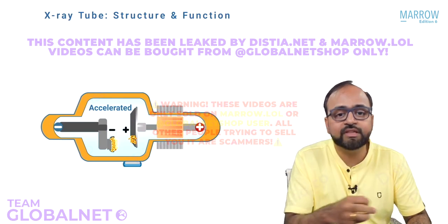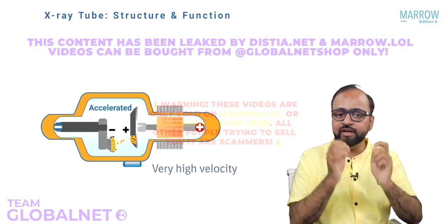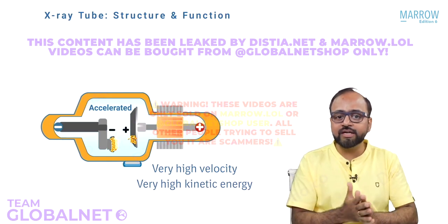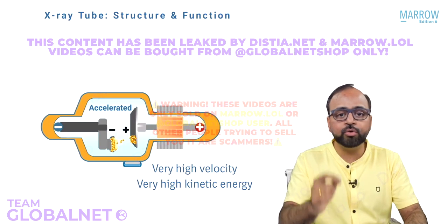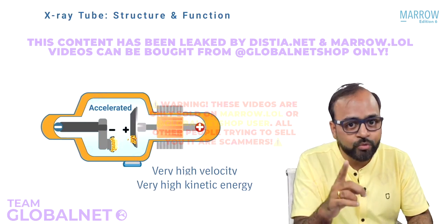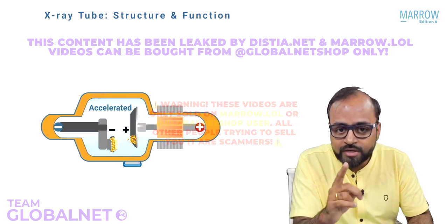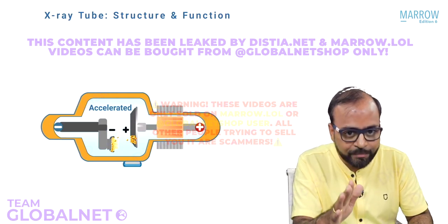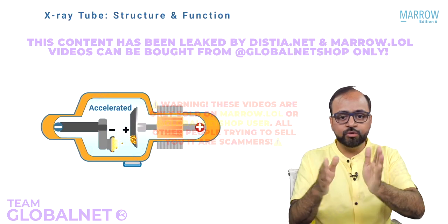So what is going to happen? When they are accelerated, they are moving at very high velocities, very high kinetic energies, and with this high velocity and high kinetic energy, they are simply going to go and hit the anode. And when they hit the anode, something magical is going to occur.